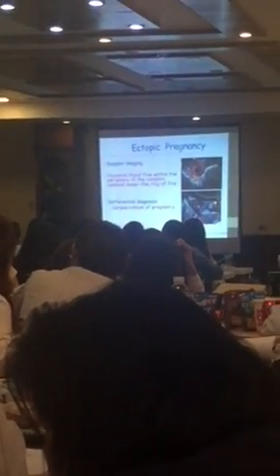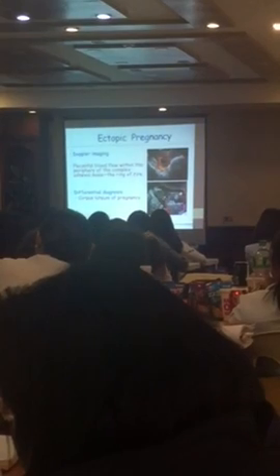Another differential diagnosis that usually causes you to miss an ectopic pregnancy is the presence of corpus luteum. Why? Because both exhibit ring of fire colored flow. An ectopic will exhibit the same as well as corpus luteum. So be careful if an image is flashed in your test paper.